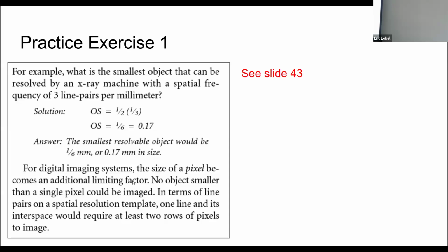So if you have a really cool CT, MRI system, but you hook it up to your Holly Hobbie, remember Holly Hobbie? It was like the little toy oven, but I was going to turn it into the little toy television because none of you guys will understand anyway. Some of my weird analogies. Anyway, if you hook it up to some terrible monitor that you bought for $100, it's not going to show up, right? So it's really important to have small pixels.